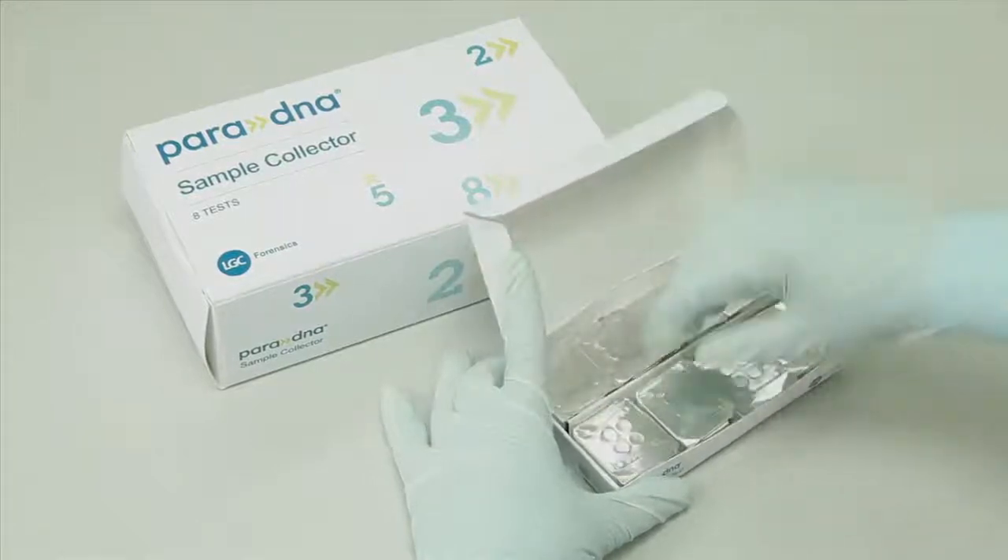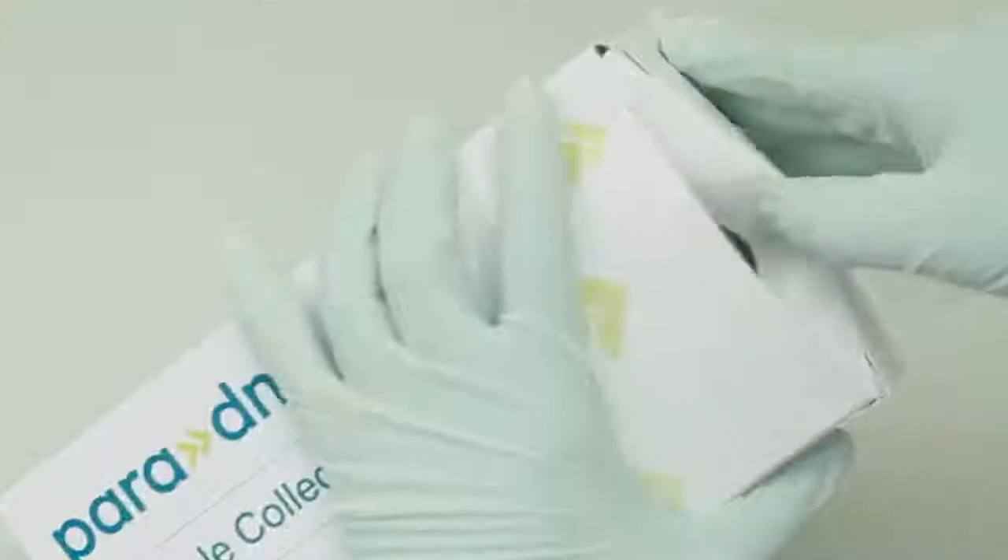You need to wear personal protective equipment. Each sample to be screened for DNA requires a reaction plate and a sample collector.